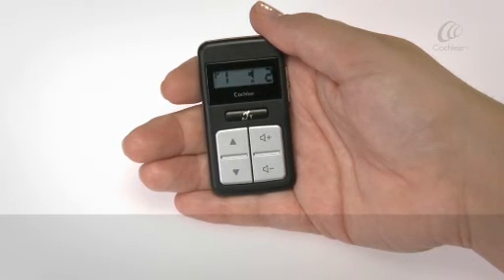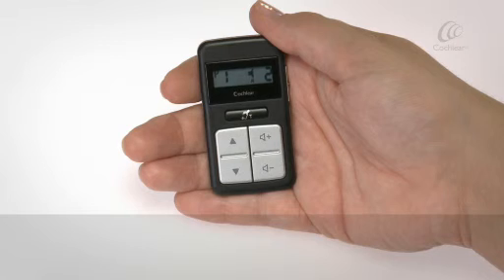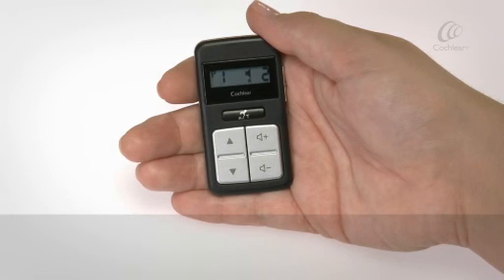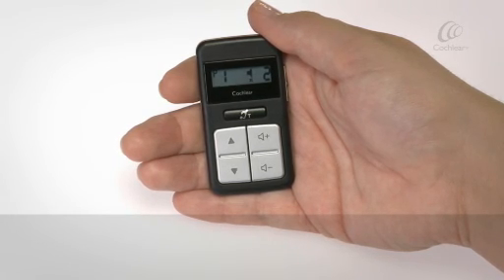When you turn on the remote control, it always displays the current volume or sensitivity settings, even if you've adjusted the volume or sensitivity using the processor buttons or the remote control.